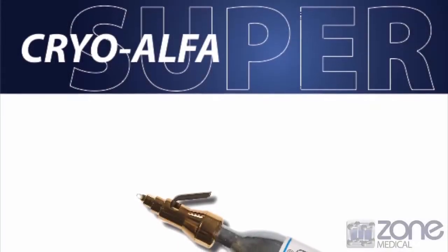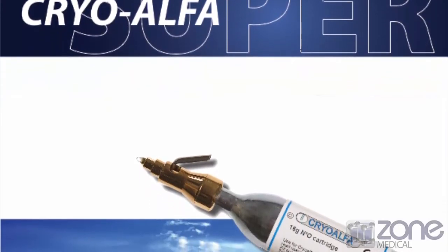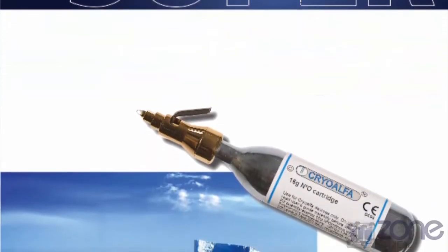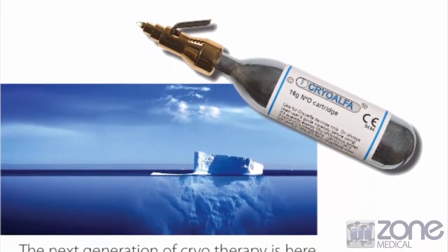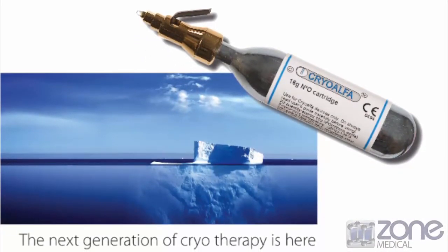I'm going to be speaking to you about the CryoAlpha SuperContact liquid freezing system. Cryotherapy with the CryoAlpha may now be routinely applied in all doctors' practices and hospitals because of the worldwide acceptance by patients. The CryoAlpha meets all expected demands in modern cryotherapy.